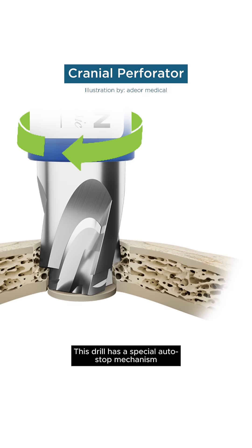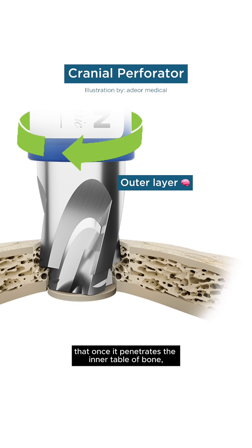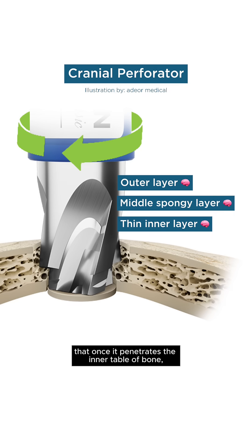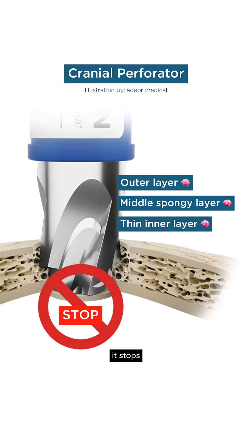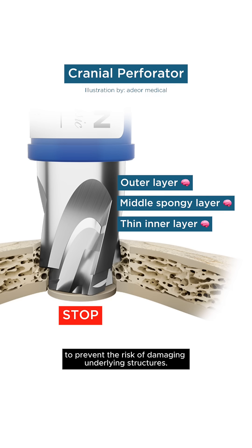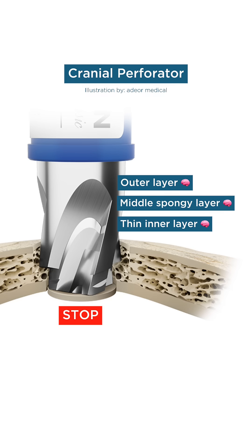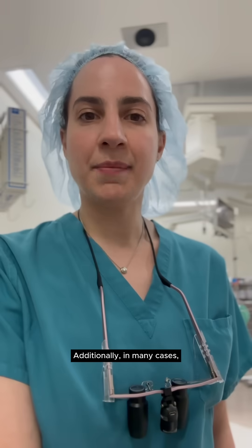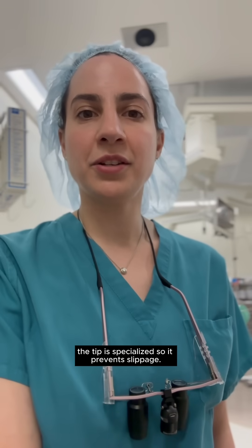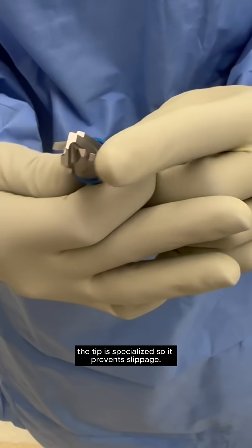This drill has a special auto-stop mechanism that once it penetrates the inner table of bone, it stops to prevent the risk of damaging underlying structures. Additionally, in many cases, the tip is specialized so it prevents slippage.